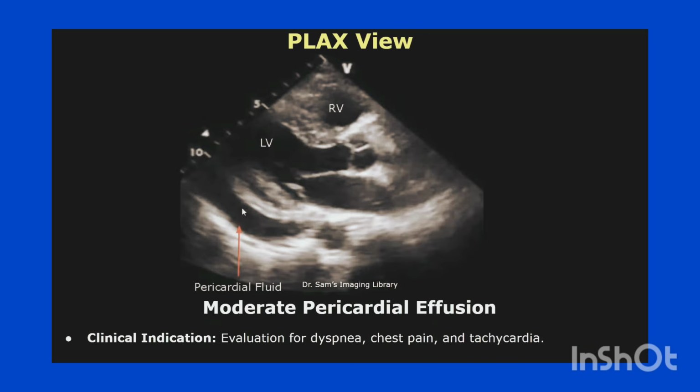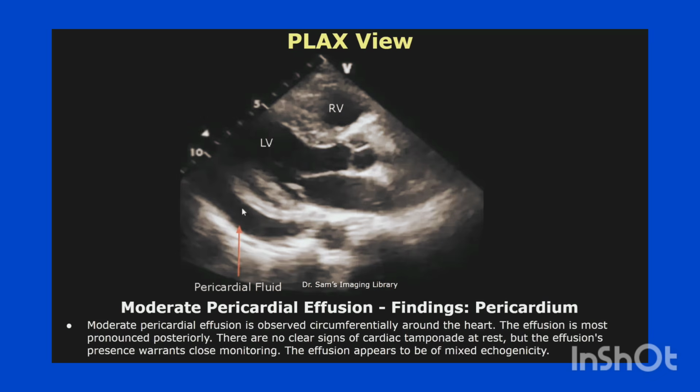Now we have a case of moderate pericardial effusion. Clinical indication is evaluation for dyspnea, chest pain, and tachycardia. These are the findings in the pericardium.